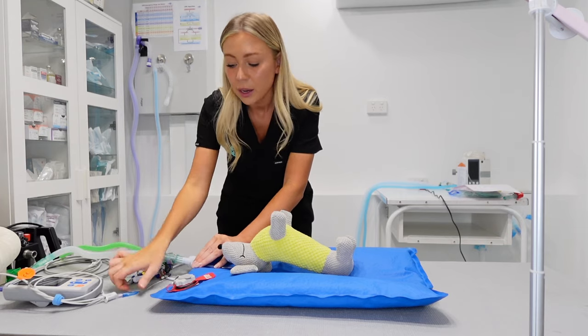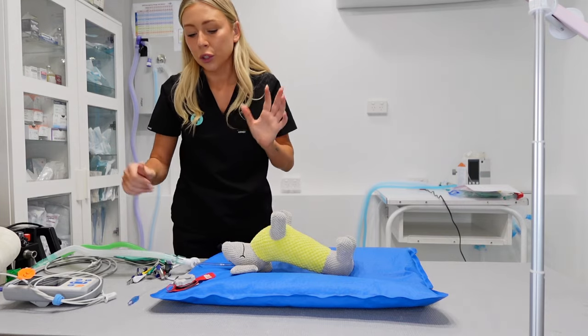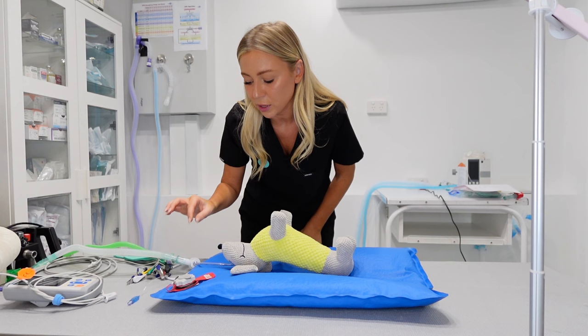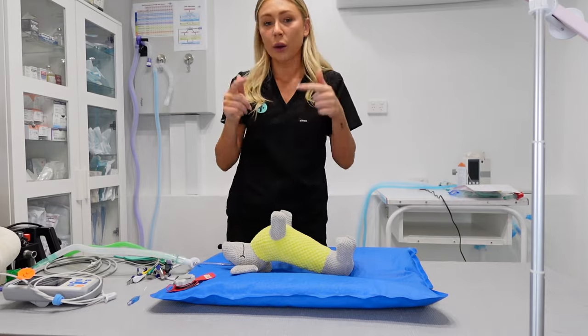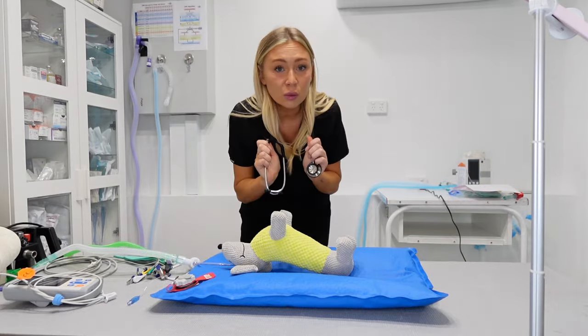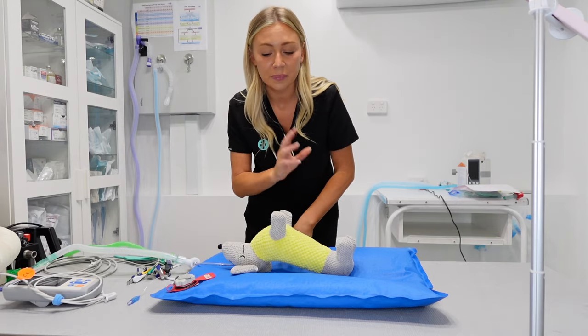Say that is all connected — make sure that your tube cuff is done up. I haven't checked my patient yet, so I would, in this instance, be checking heart rate with a stethoscope, doing a manual check at this stage, and then moving on to attaching a sensor.